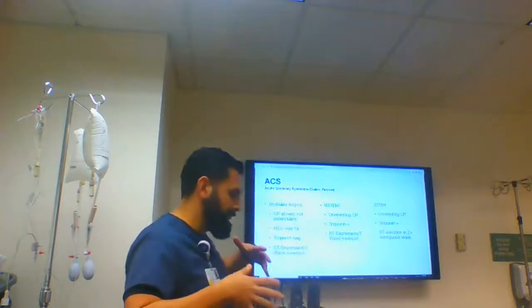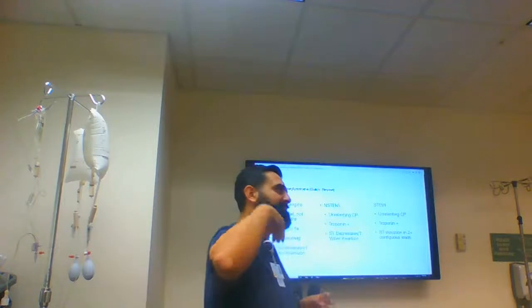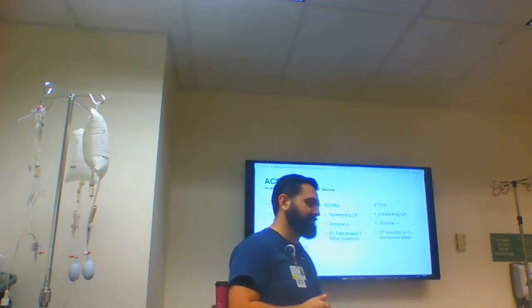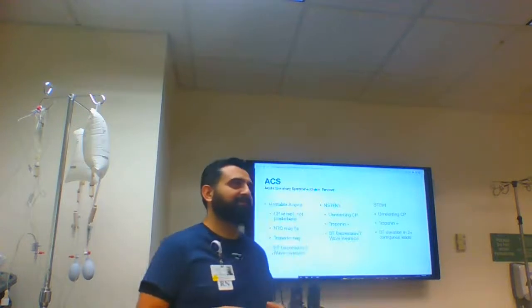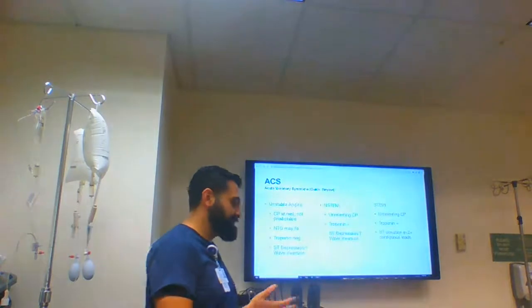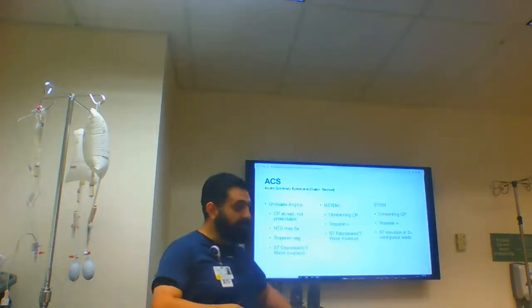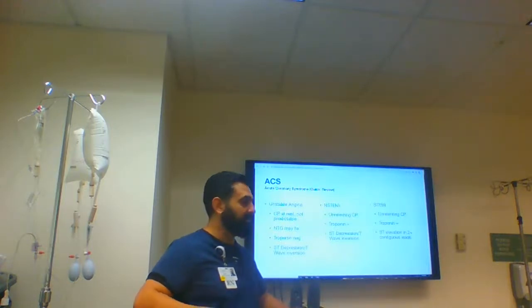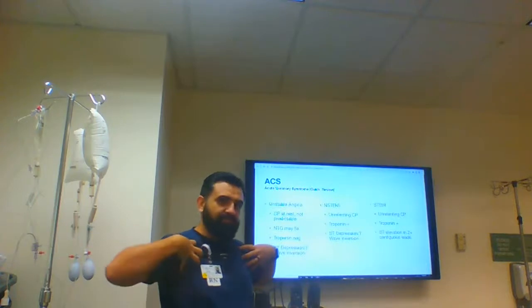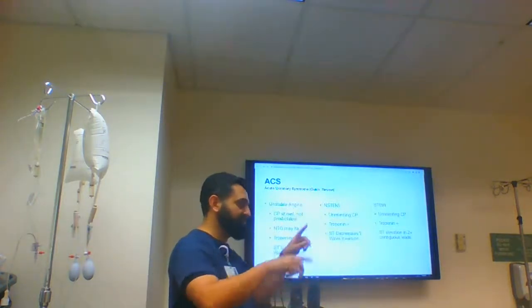One of the topics that has lately come up on a lot of Facebook posts and things like that is, why can't we make a wireless EKG, right? The answer is we could, but each electrode would need to have its own electric component. So you would have huge electrodes, because they need to be in constant communication with each other. Otherwise, they don't make those virtual leads.